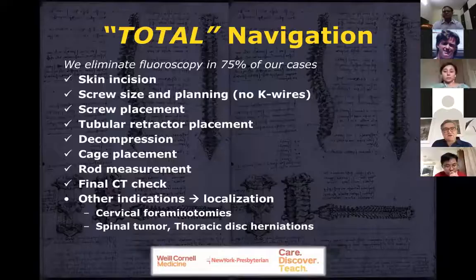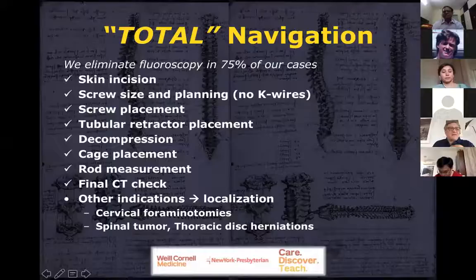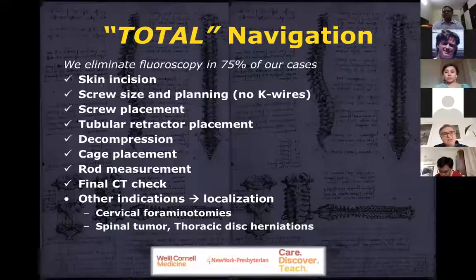I've been using navigation for 15 plus years, first in brain surgery, and then when I started doing spine surgery, we translated that. We now use it for about 75% of our cases. There's hardly any fluoroscopy being used, and nobody wears lead. We use navigation from start to finish: to plan the skin incision, to insert the screws, to place the tubular retractor, to do the decompression and so forth. Like everything with technology, you become used to this and you extend the applications.